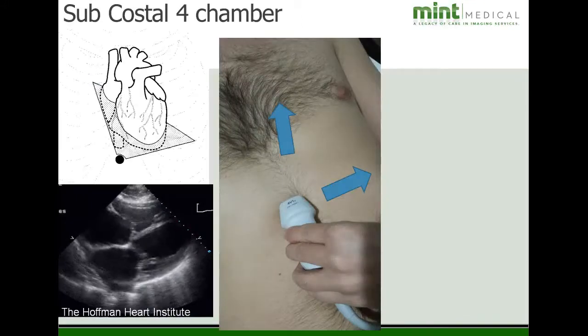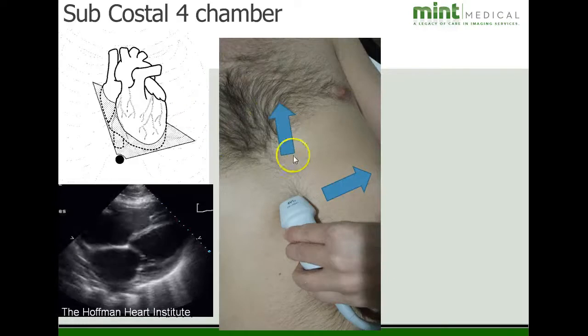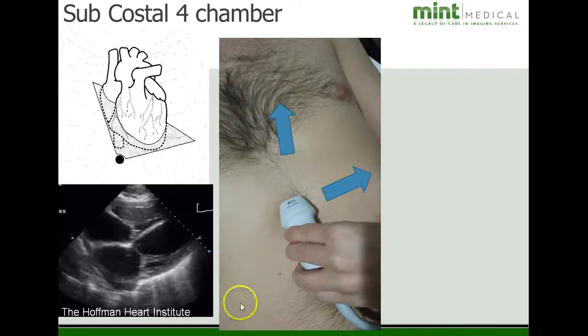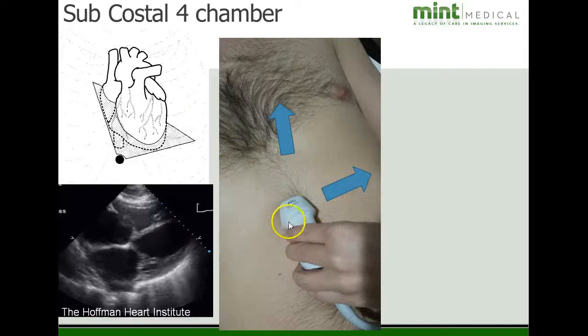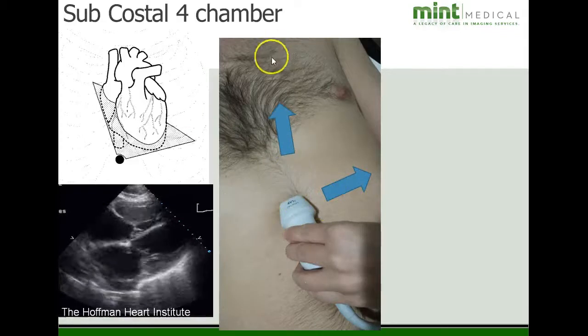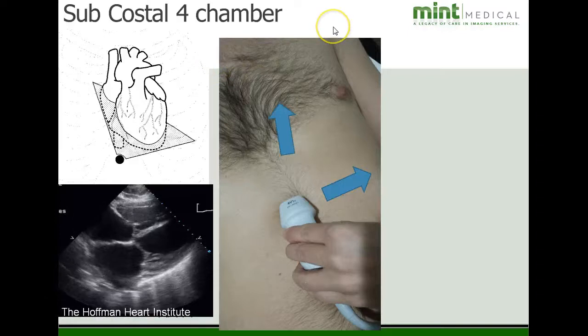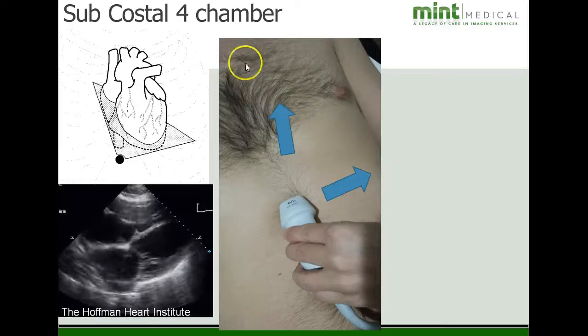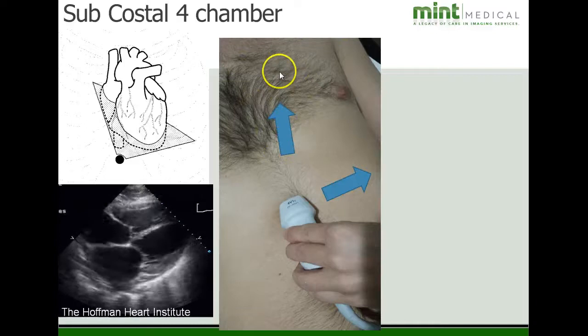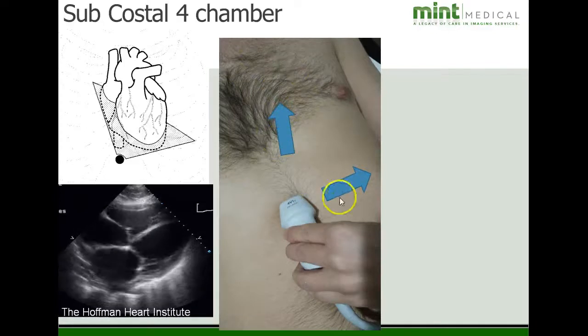The next picture we'll be taking is from the subcostal window, and basically it's going to be just below the subxiphoid process and between the ribs, and we're going to be angling our transducer towards in between the patient's sternum and left shoulder where the heart's present right here. You're going to angle your transducer towards that angle, and your indicator is going to be at 3 o'clock.